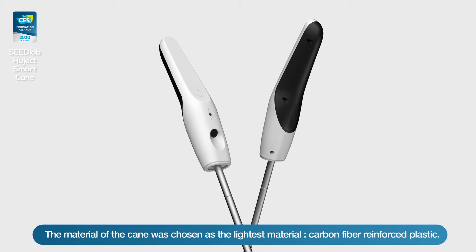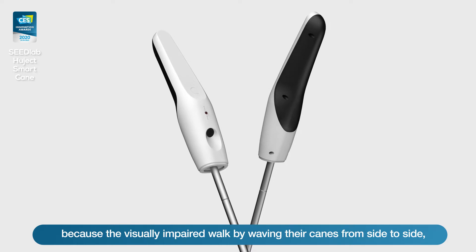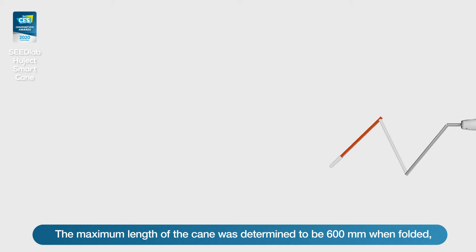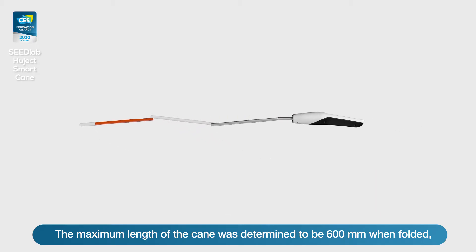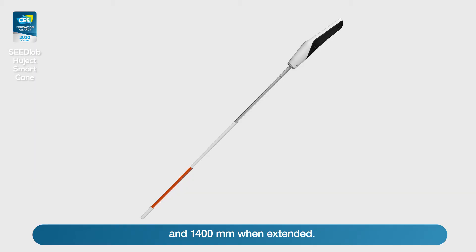The material of the cane was chosen as the lightest material because the visually impaired walk by waving their canes from side to side. The maximum length of the cane was determined to be 600mm when folded and 1400mm when extended.